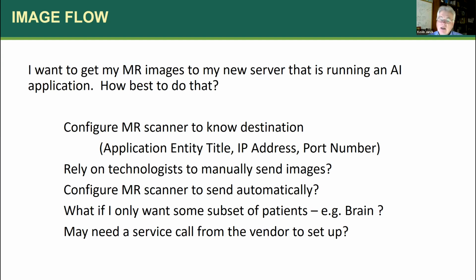So can I do that with my MR scanner? What if I only want some of the images? This particular AI algorithm that I have looks at brain images, brain MR images. It doesn't care anything about abdomen exams or hip exams or knee exams or anything else.